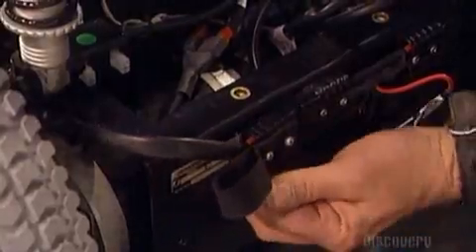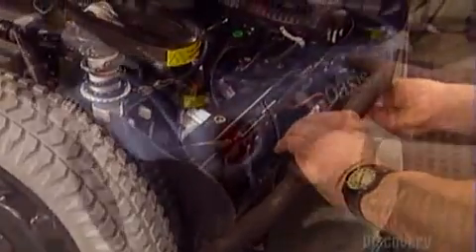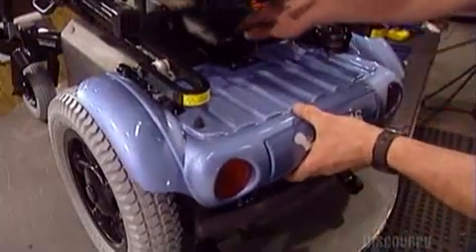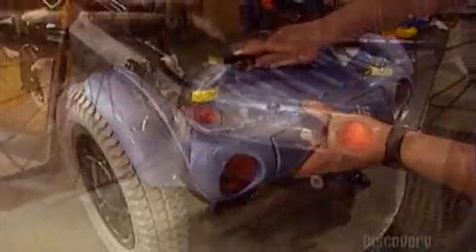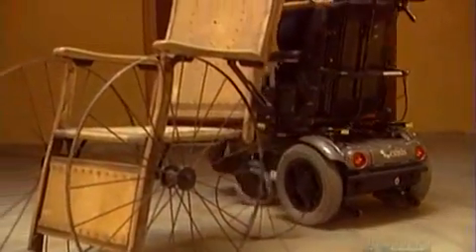The batteries connect to the charger and controller to power up the wheelchair. A steel bumper and plastic rear hood called the shroud protect the back of the wheelchair from the elements and against minor collisions. This motorized model can glide at a leisurely pace or zoom around at a top speed of 12 kilometers an hour.